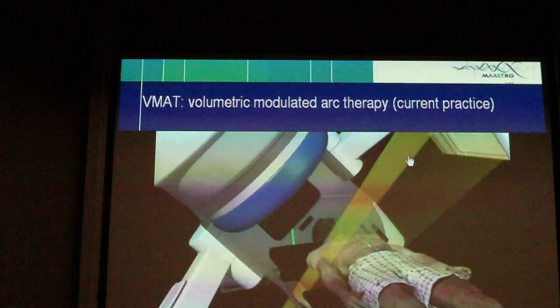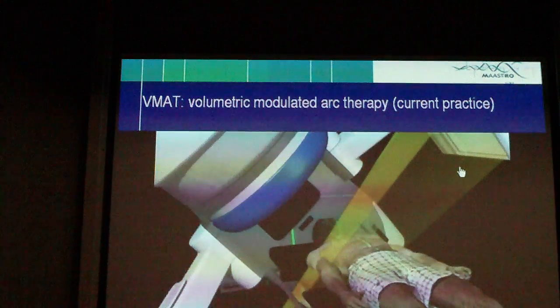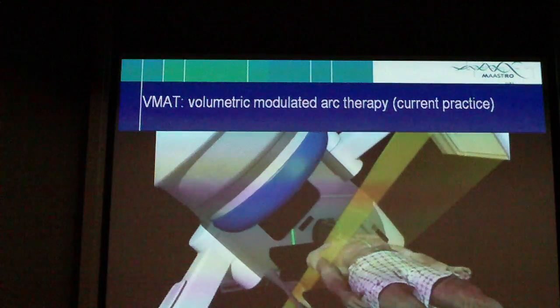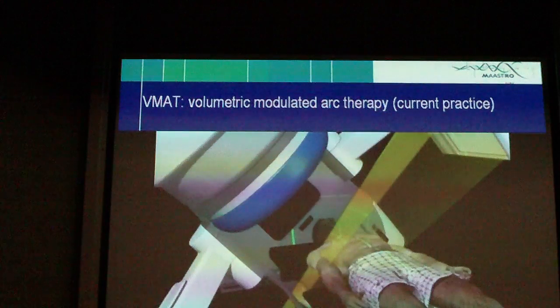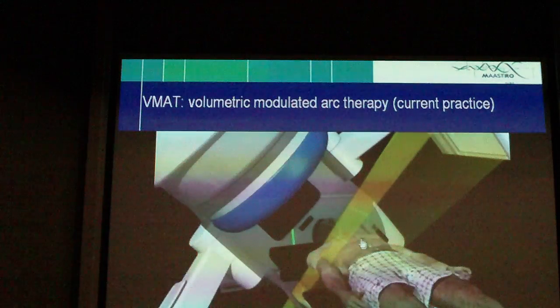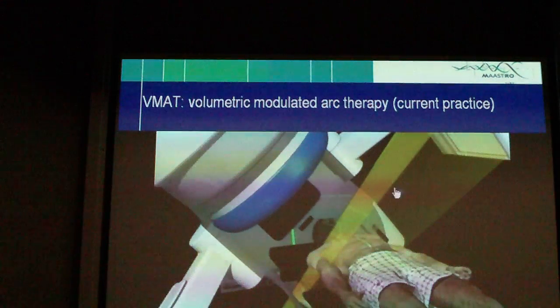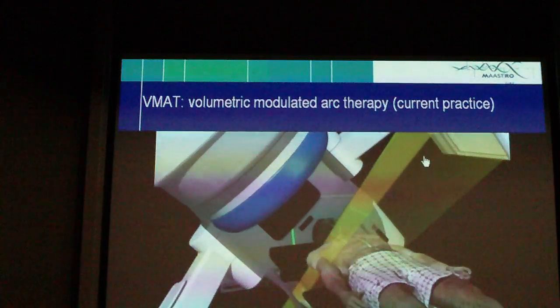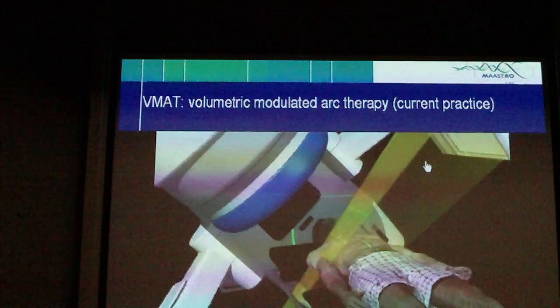So this is sort of an animation which is not working. Yeah, sorry for that. So essentially it's the same Linac. Now the collimator is over here, so the Linac is also able to rotate around the patient. So the beams are coming from here and go through the patient. So this is a patient with a lung tumor. Well, you don't see a tumor, but you see the beams going through the lung area. And then the beams travel further and further on and end up in an imaging panel. So we do imaging during radiotherapy to see where dose is delivered.